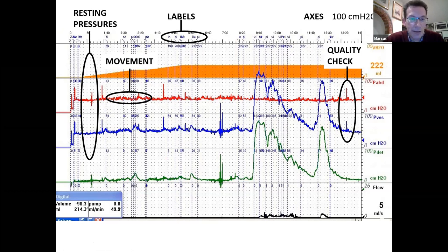Now there's an interesting aspect of the trace here. Just straight after we start recording from the patient, if I could get my arrow to appear on my laptop, here it is. So you see a little jump here and a further jump here as we go between zero to atmosphere and full recording from the patient. Would anybody like to suggest why there is an additional leap here when we switch from recording to atmosphere to recording to patient? Any thoughts on that?